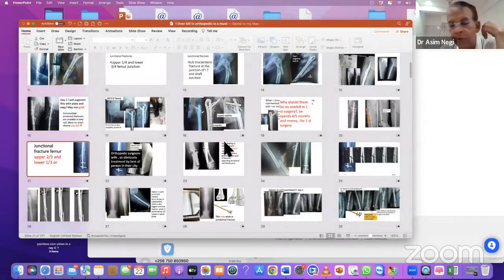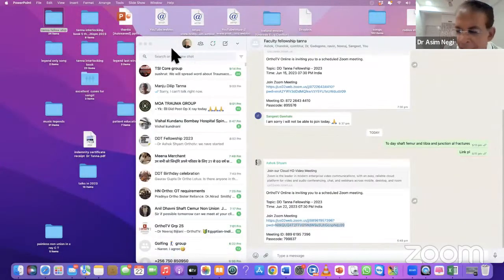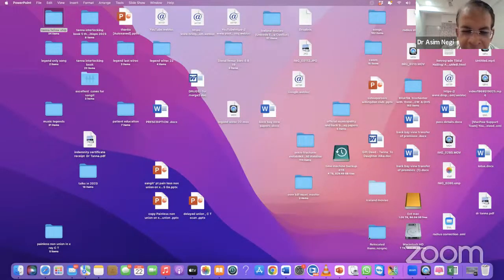Yes. You talked about distal femur nail efficacy. Most of the people will be misguided. They think of the old short distal femoral nail with uniplanar locking bolts and only 2 proximally and 2 distally. What you mean is a longish nail going up to the lesser trochanter and has 5 locking bolts in the distal segment, the long distal femoral nail, the newer design. It's not the short 2-screw distal femoral nail. So there should not be any confusion.